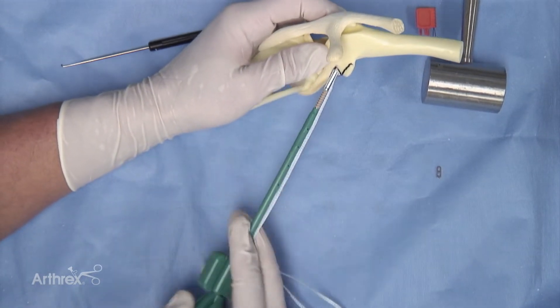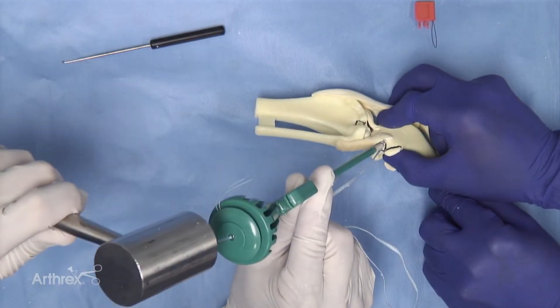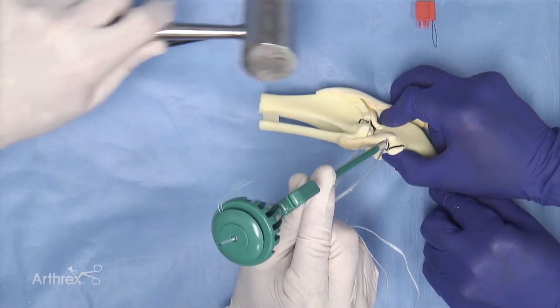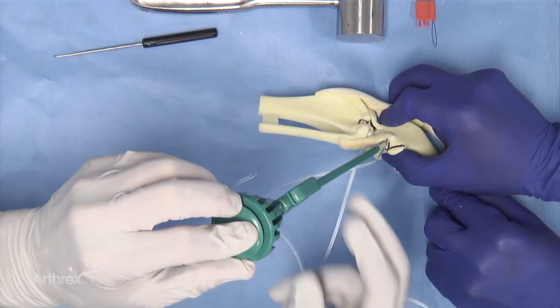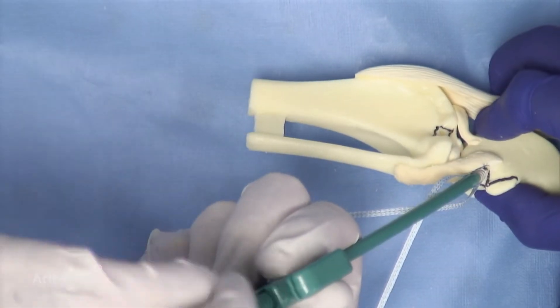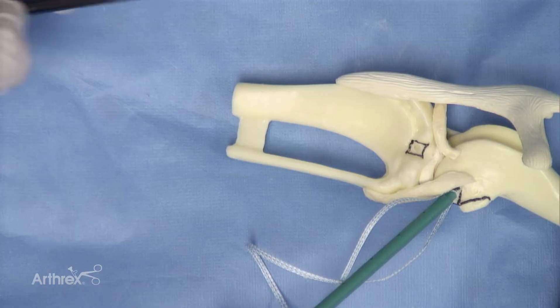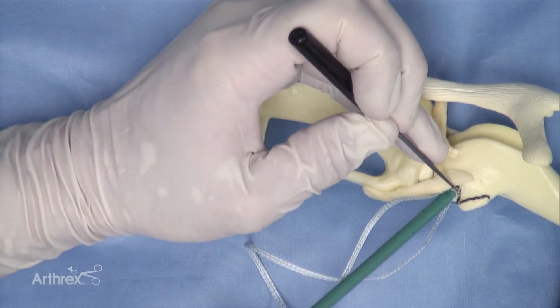The initial travel direction of the implant is ascertained. Several taps with a mallet are performed to ensure the swivel lock implant contacts the bone model. By holding the square and turning the driver, the swivel lock implant is placed into the femoral socket until it reaches a level where the implant is completely inserted.